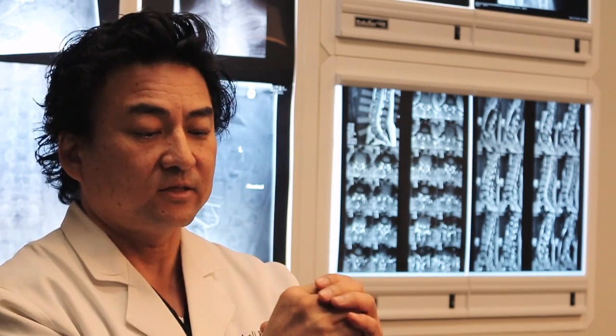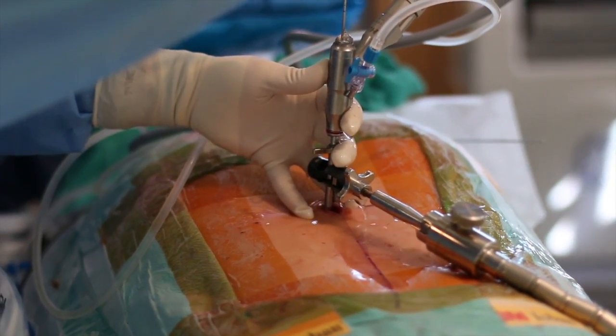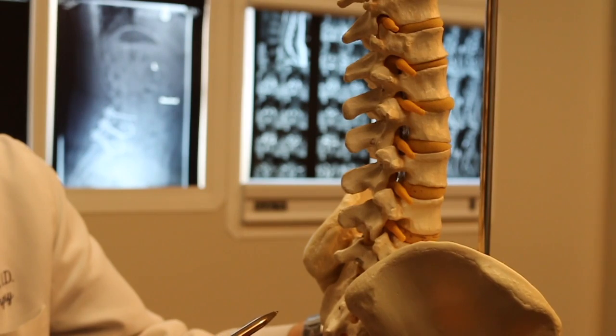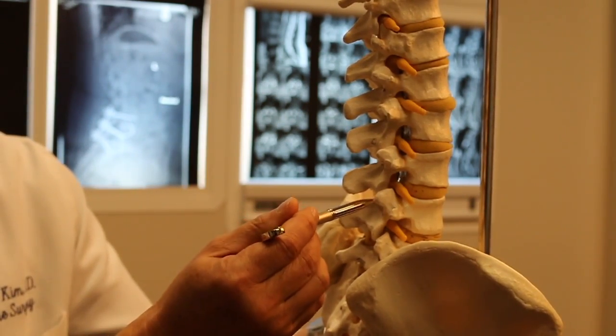We can also do the surgery using a more minimally invasive technique, and that's using the laser endoscope. Instead of making a one-inch incision, we make a much smaller incision and use an endoscope to visualize the surgical target site. The way we do that surgery is to come in a little bit from the side, so that we avoid all the powerful muscles in the back.